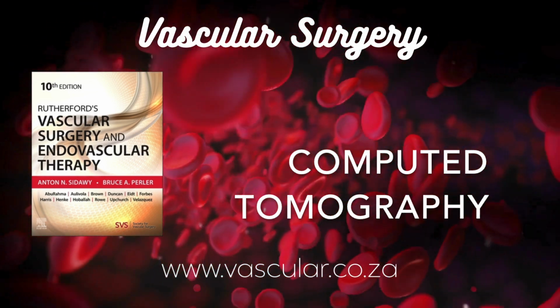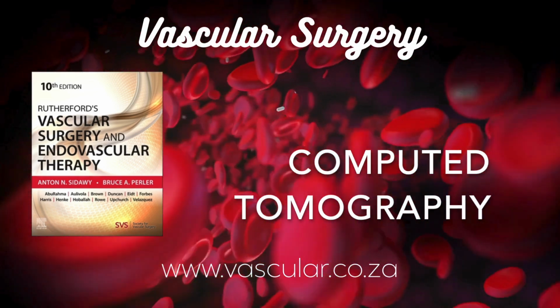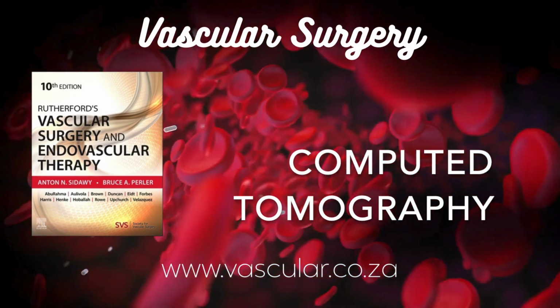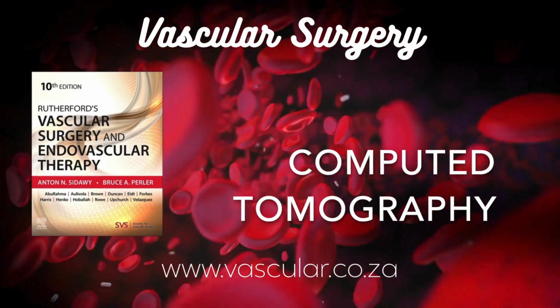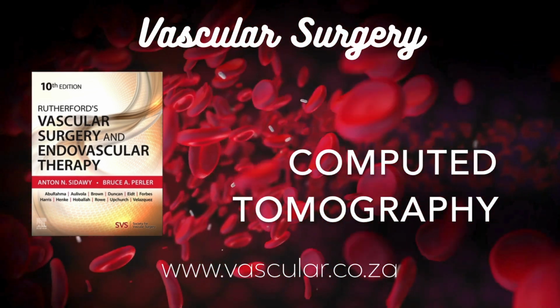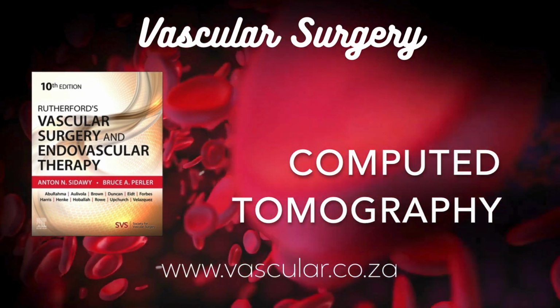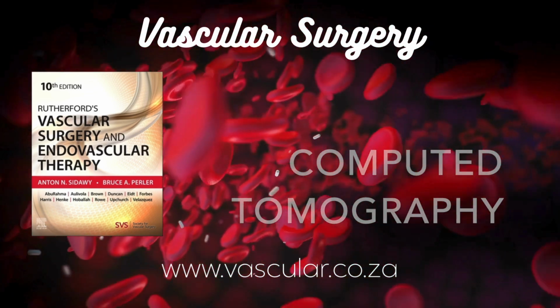So what's the best way for measurements, especially for complex stuff like aneurysm repair? That's where 3D reconstruction really shines, combined with those perpendicular reformats for diameter. Specialized software, often used for endovascular planning, can automatically detect the center line of flow within a vessel, even a really tortuous one. Centerline? Yeah, it tracks the middle of the blood flow path. Then it can calculate the precise length along that center line, which is exactly what surgeons need for sizing grafts. It's incredibly valuable. Speeds things up too, I bet. Massively. Quickly understanding the aneurysm's shape, where it starts and ends, finding suitable neck lengths for sealing the graft. It's all much clearer with good 3D CTA.